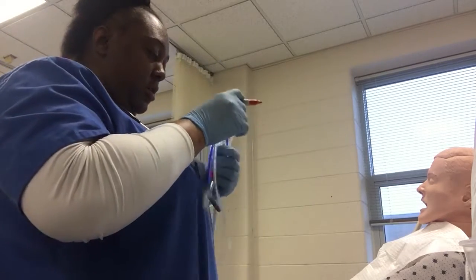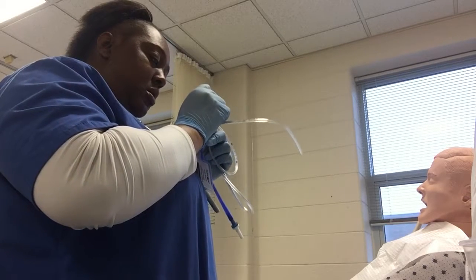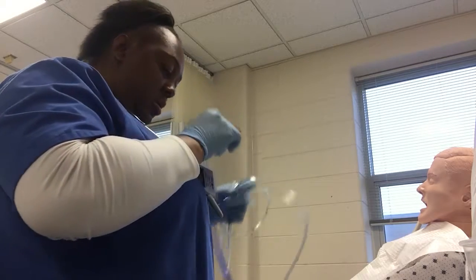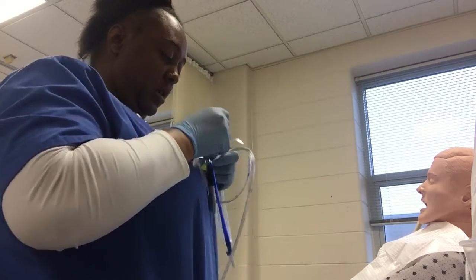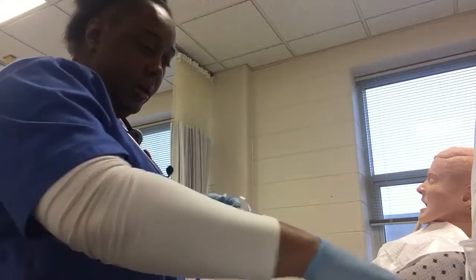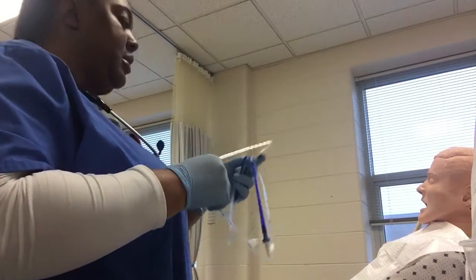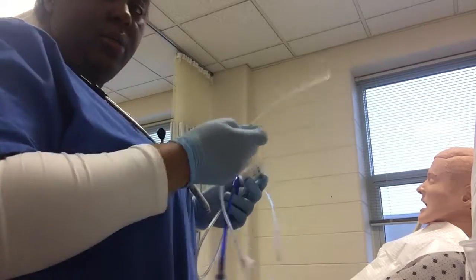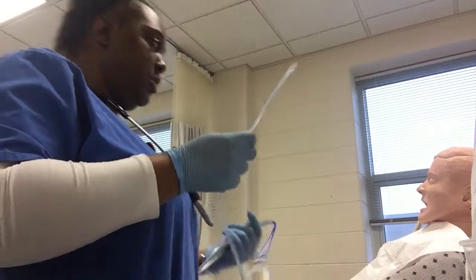I'll mark it as well, with the red marker. Now I will lubricate 3 to 4 inches of the tubing.